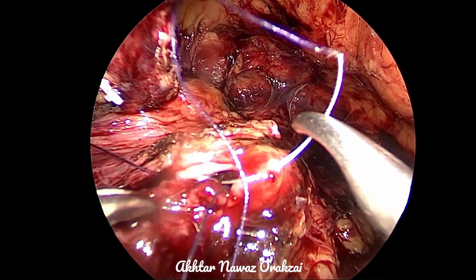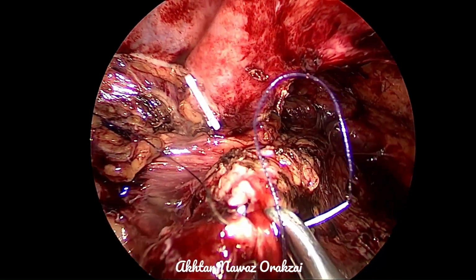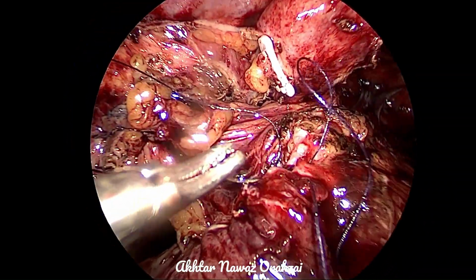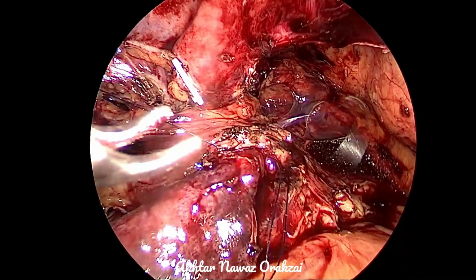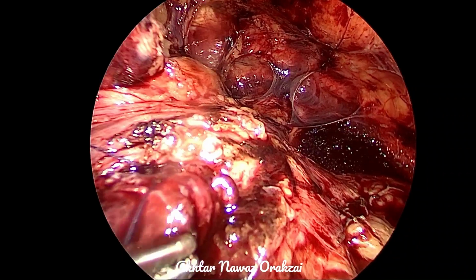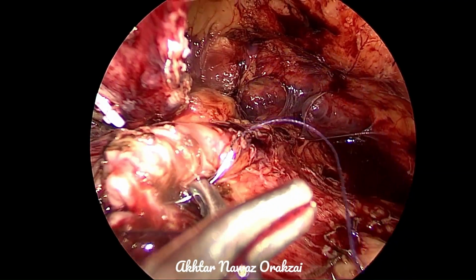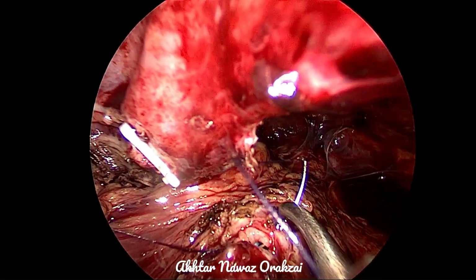It is important not to grab the ureter itself with the traumatic forceps. We are holding the ureter by the peri-ureteral tissue, because trauma can also lead to ischemia and again fibrosis. So this is the last stitch, it's the corner. It's important not to take the stent again. It must be under vision.